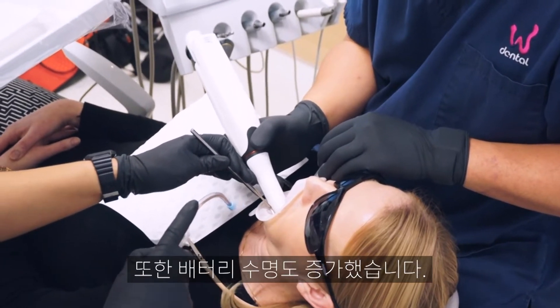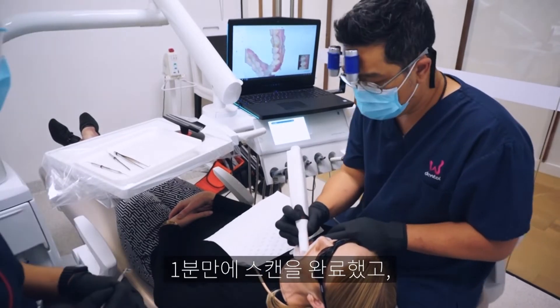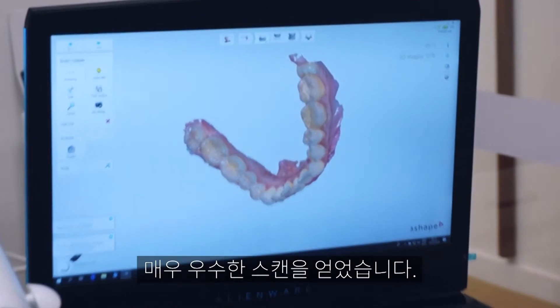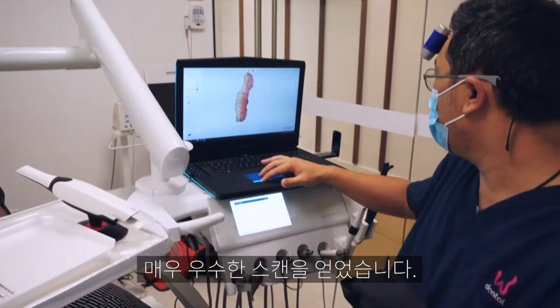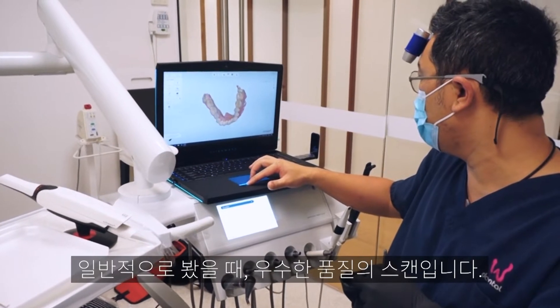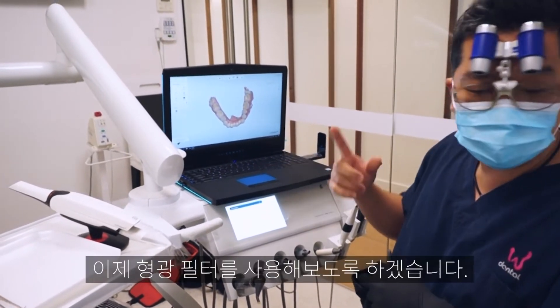The battery life seems to be better. Just over a minute — not too bad for our first try. Pretty good scan there; a couple of holes we can go through, but generally that's not a bad scan at all.